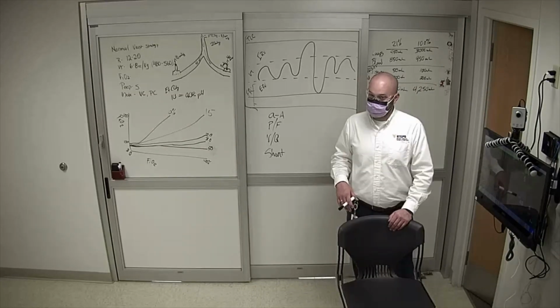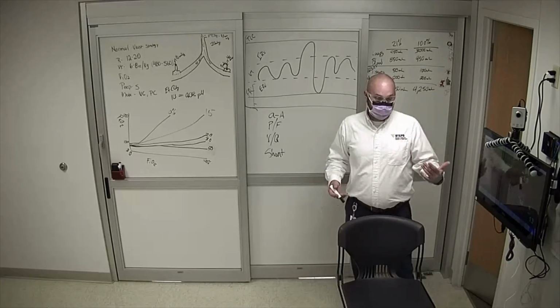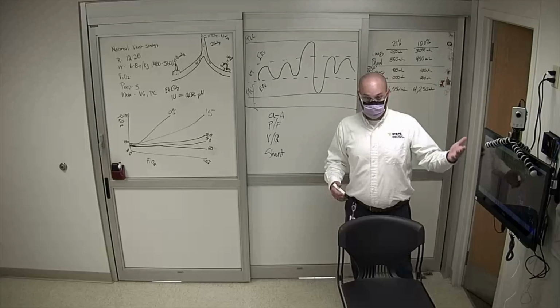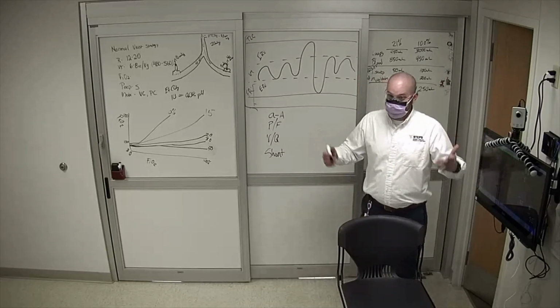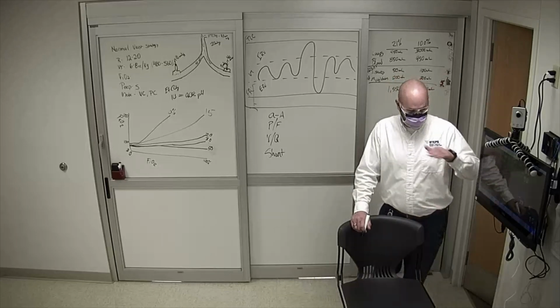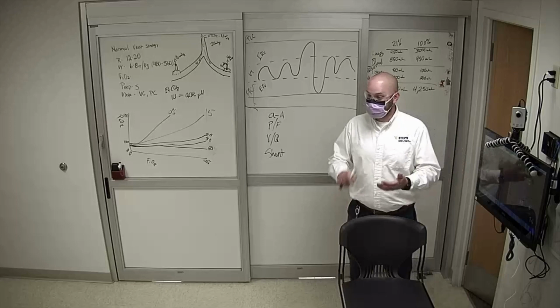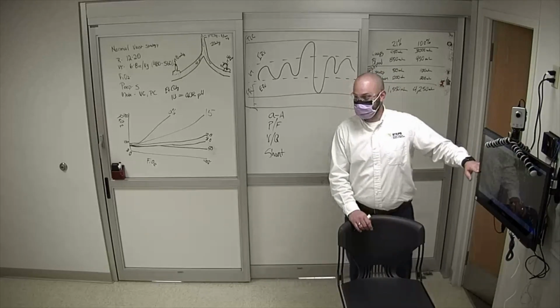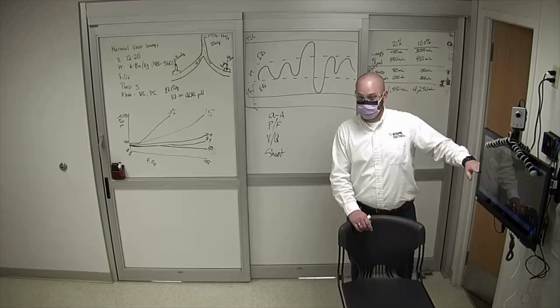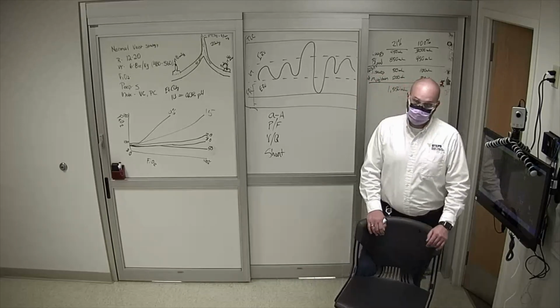We're not using end tidal to its full potential, I found, in the hospital. It's something EMS has been doing a long time, but for whatever reason, the hospital's been really slow to pick up on this. I love it on the ventilator because it's giving me real-time information, and if you know how to use it, it's already there. It's already hooked up. If I'm making a bunch of vent changes, I want an end tidal number because I know exactly what I'm doing. Not only do I have oxygenation and ventilation, but now I can also relatively guess my blood gas, a reference point.